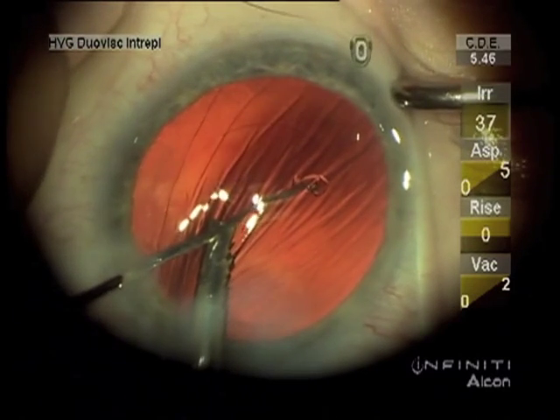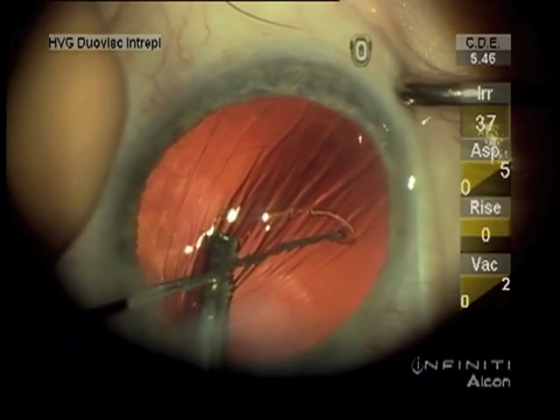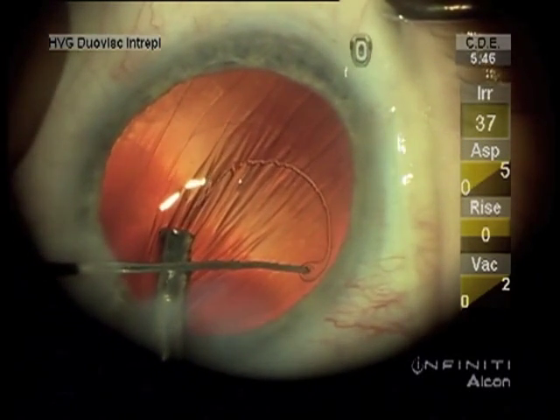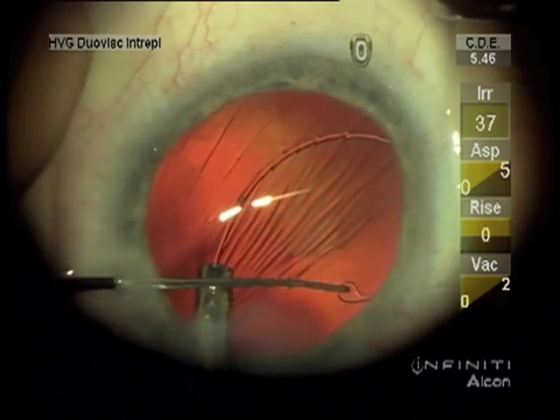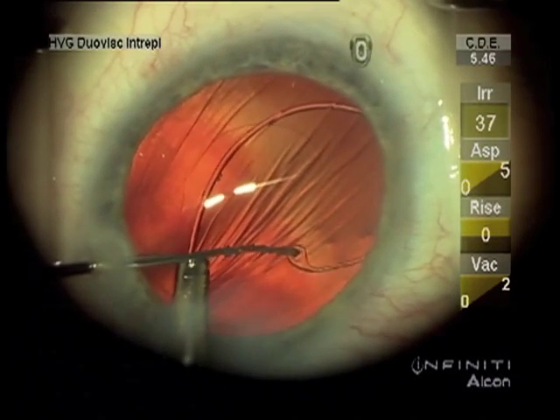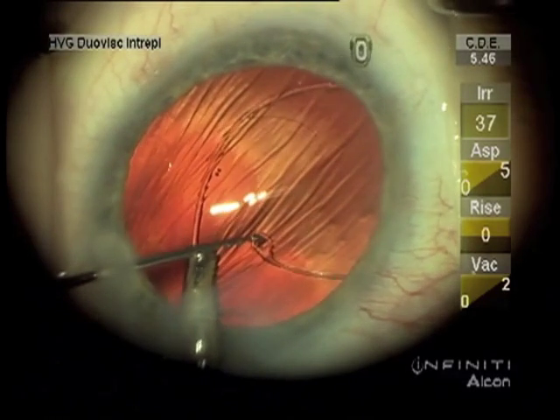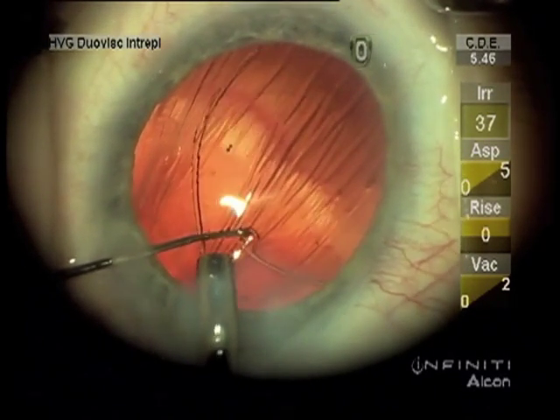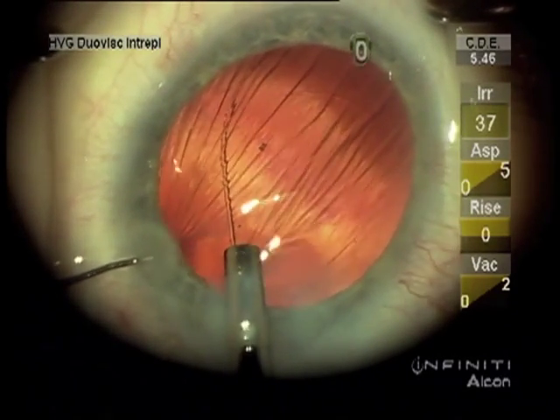Then once there is a large enough bend, it can be released. Here's an example using it just for a capsular tension ring alone. I'm pushing against the incision too much on the left, creating that stria in the cornea, but it still shows the technique of holding it with the Sinski hook until you get enough bend.